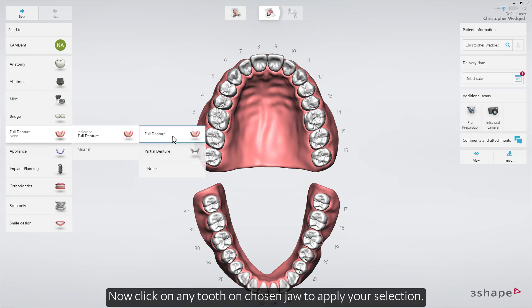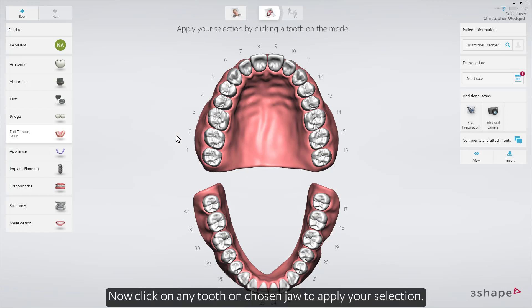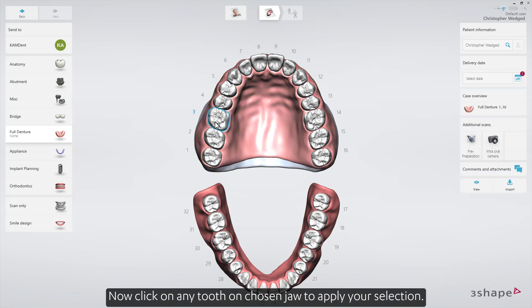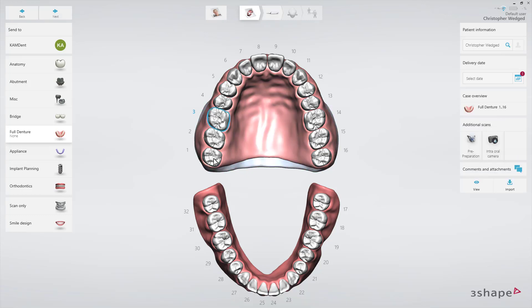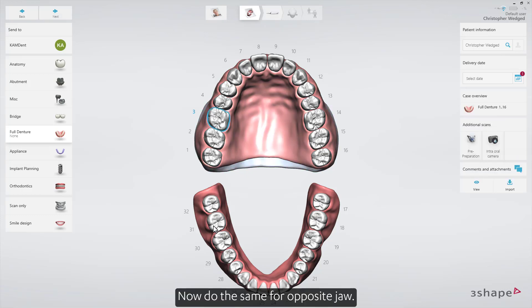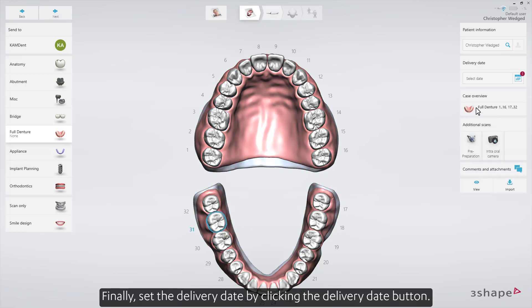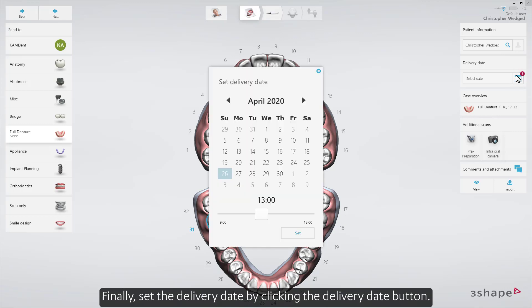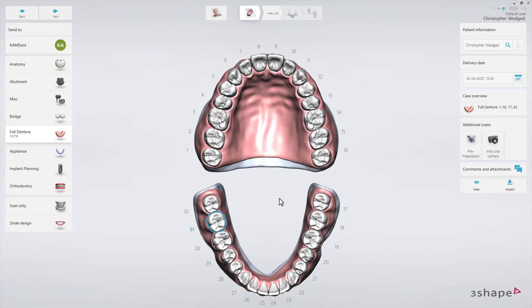Now click on any tooth on the chosen jaw to apply your selection. Now do the same for the opposite jaw. Finally, set the delivery date by clicking the delivery date button.